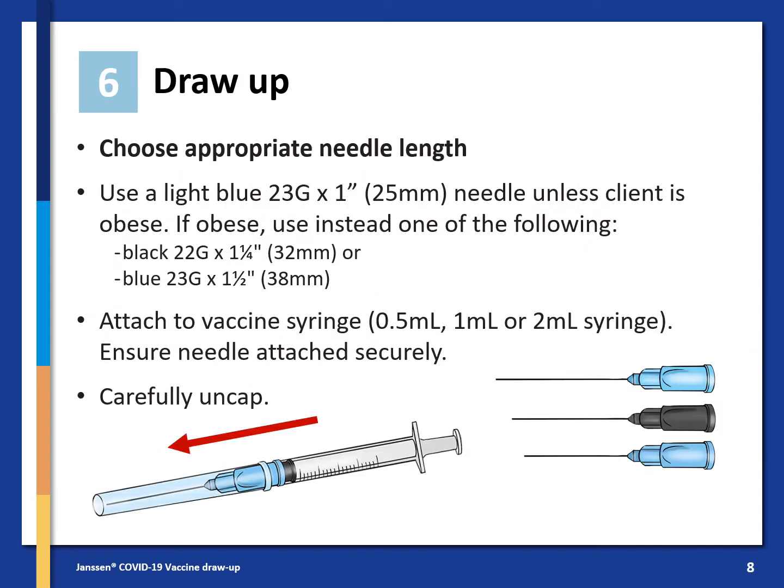To draw up the dose, choose an appropriate needle length. Use a light blue 23 gauge 1 inch needle unless the client is obese. If the client is obese, you will need a slightly longer needle to ensure delivery into the muscle — either a black 22 gauge 1.25 inch or a blue 23 gauge 1.5 inch needle. Attach the selected needle to the vaccine syringe, which could be a 0.5 ml, 1 ml, or 2 ml syringe. Ensure the needle is attached securely, then carefully uncap the needle.